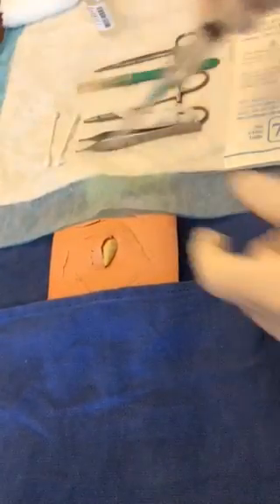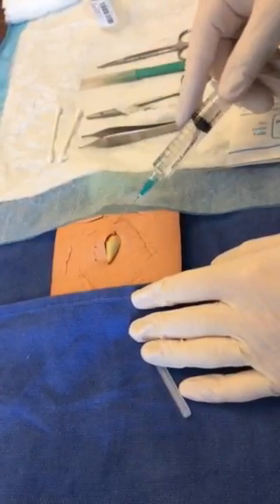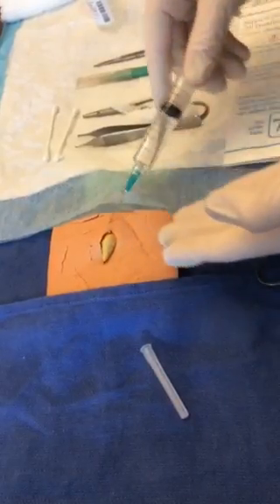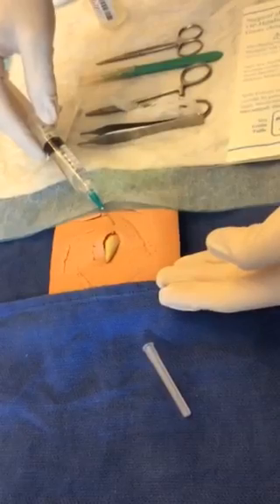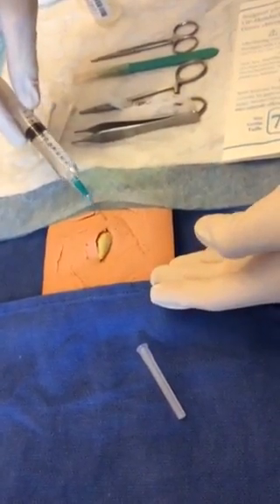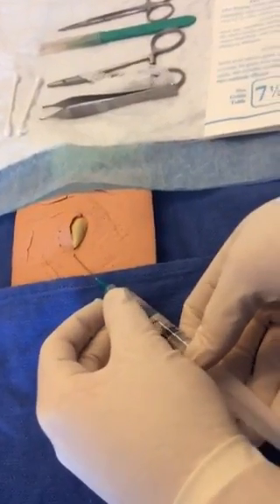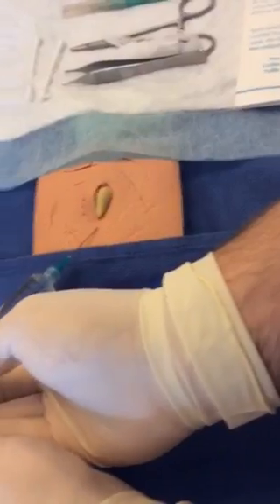We're just going to try to make it as sterile as possible to minimize infection. So what I'll do first is I will just do a little field block here, putting the 10 cc's of lidocaine with epinephrine on the edges of the wound. What I'm doing is numbing this up so that whenever I make the incision, it will be less painful for the patient. You will tell them up front that this incision here will be painful, but it is okay.